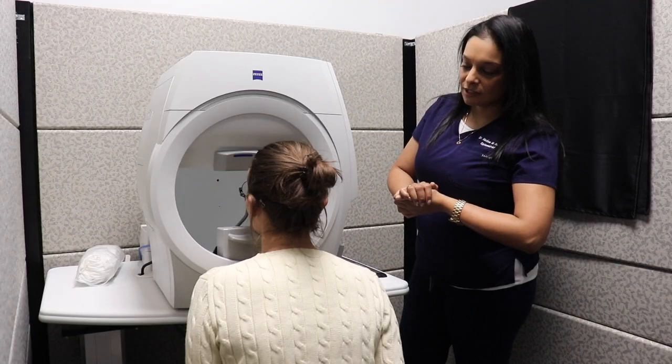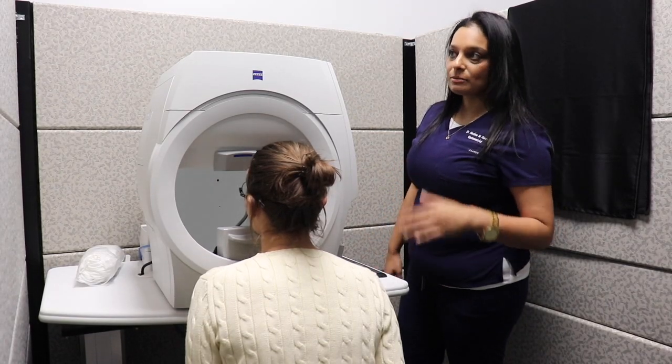As far as preparation, there's very minimal preparation required from a patient's perspective. One thing to be mindful of is that you do want to be quite alert when doing the test, so it's maybe not something you want to schedule at the end of a long work day. One of the key things a patient needs to be mindful of is ensuring they're always looking straight ahead at the fixation point and really just using their peripheral vision to respond to any lights that are presented to them.